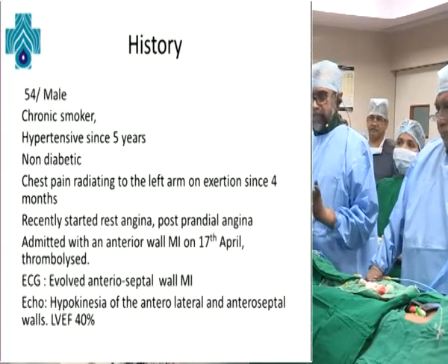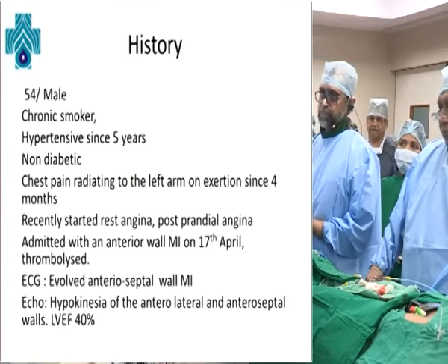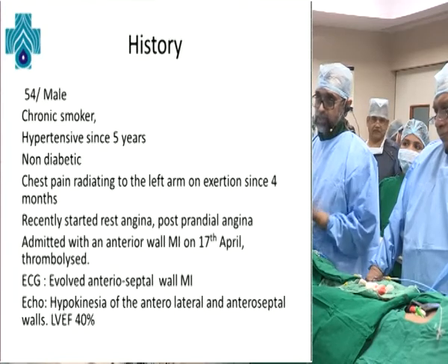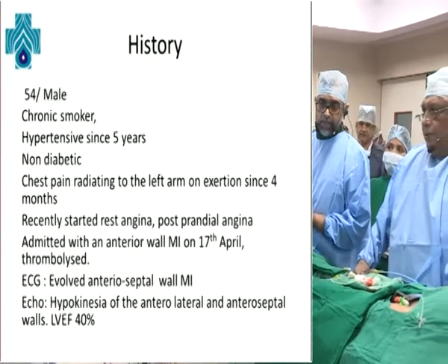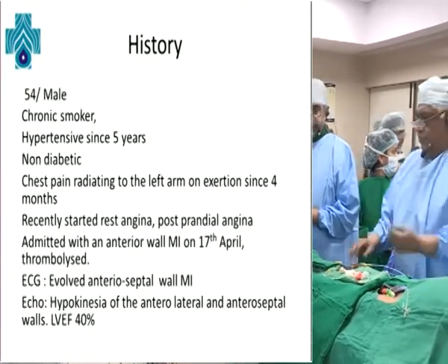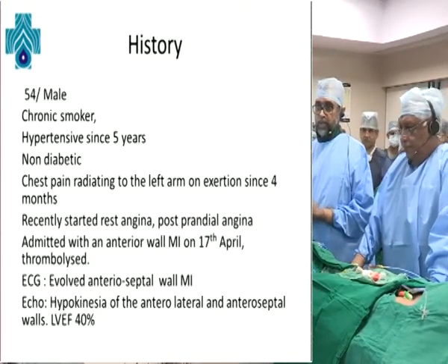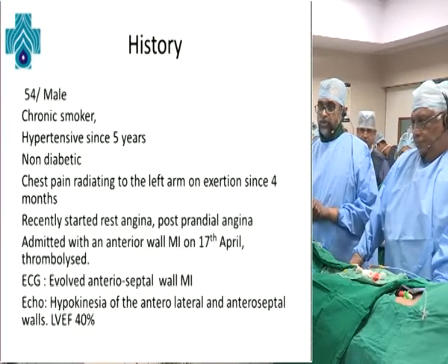Clinically, he is hemodynamically stable with a pulse rate of about 77 per minute. BP was about 130 when he came into the cath lab. Intraoperatively now it's about 170 to 180 systolic. Otherwise, there's no evidence of cardiac failure or left ventricular failure. We'll proceed to show you what the angiogram shows. The right coronary artery is normal, and this is what the left coronary system looks like.